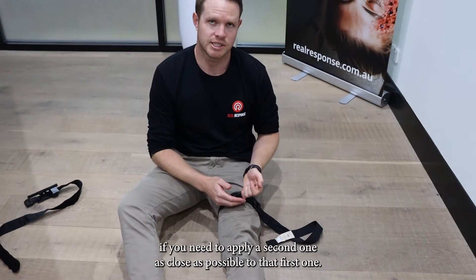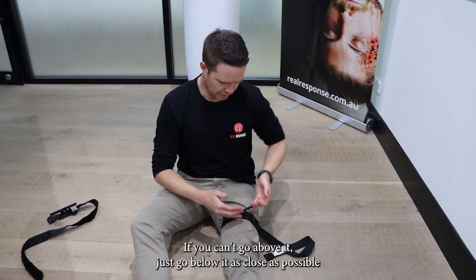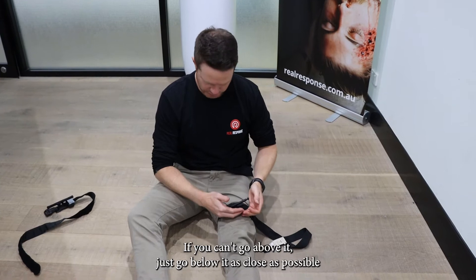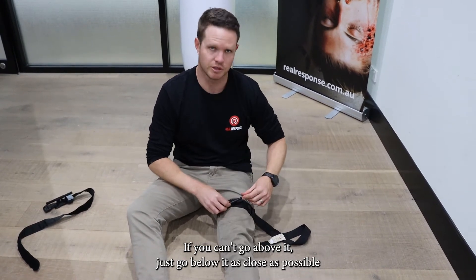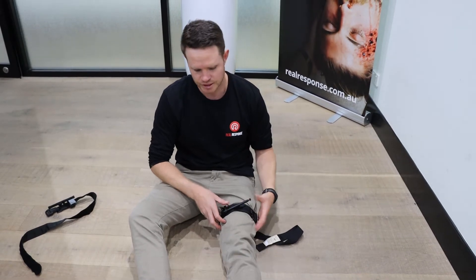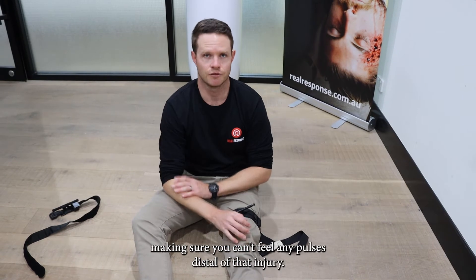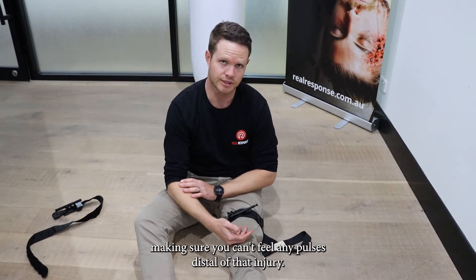Same principle: if you need to apply a second one, place it as close as possible to that first one. If you can't go above it, just go below it, as close as possible, to make sure you're getting enough pressure on those tissues. Confirm your patient still isn't bleeding and that you can't feel any pulses distal to that injury.